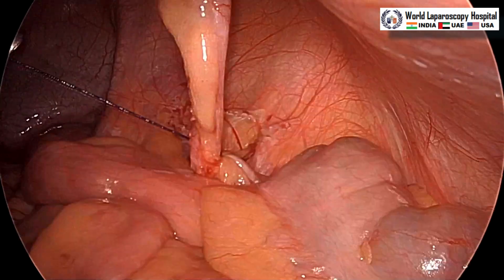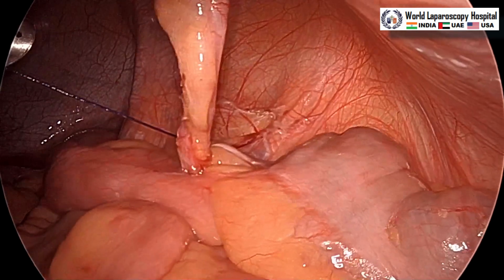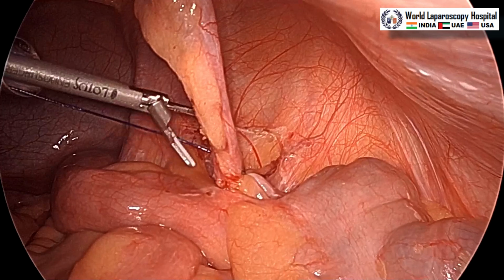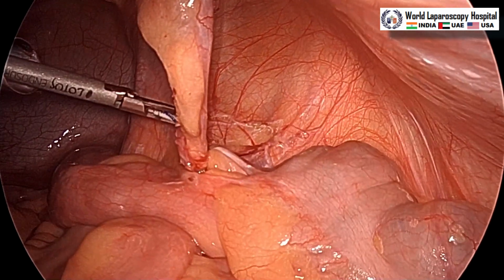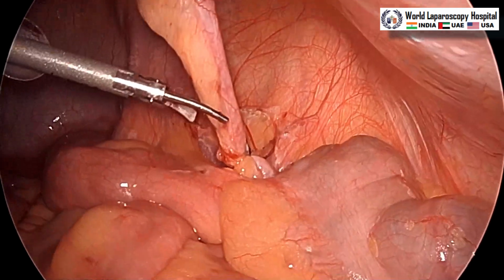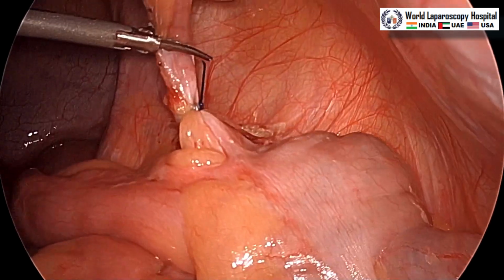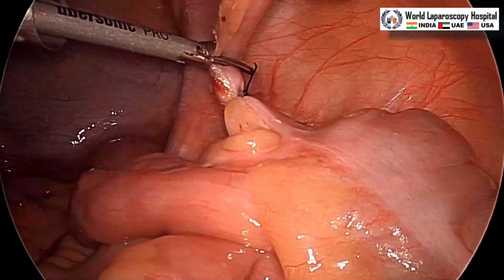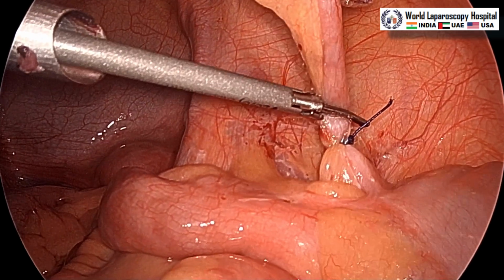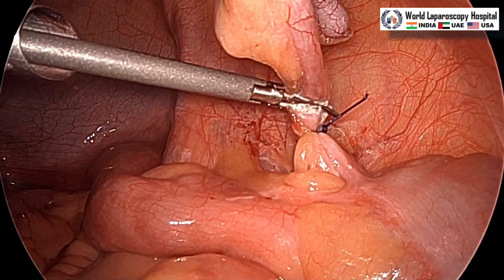So, this is done. Now, the harmonic will be introduced from the umbilical port, and then you can cut the suture with the harmonic, and after that you can cut the appendix at least 3 to 5 millimeters away from the knot, and care should be taken that this suture should not be cut accidentally with the harmonic. Distally you do not have to tie the knot because it will be sealed by the harmonic.